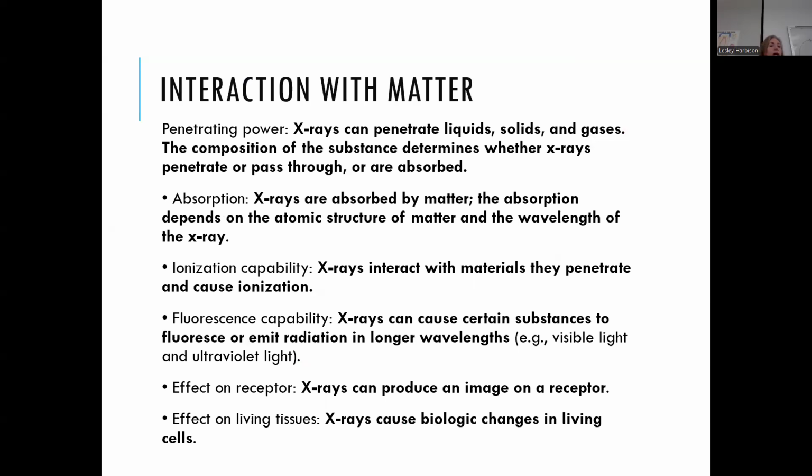Okay, so now we're going to wrap it up here. I'm going to go over these last few slides, and then I do want to spend just a few minutes with you guys talking in groups about the handout that I gave you. It asks you to summarize the production of X-rays, and then the second question says, describe how catnap can help you remember the flow of electrons in the X-ray tube head.